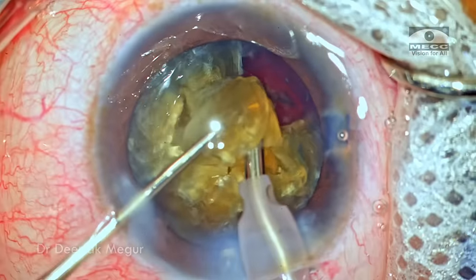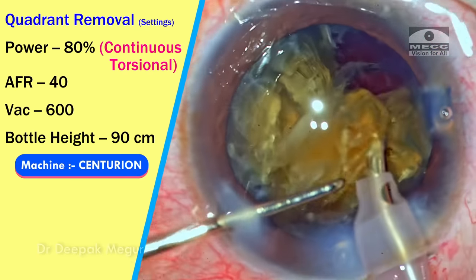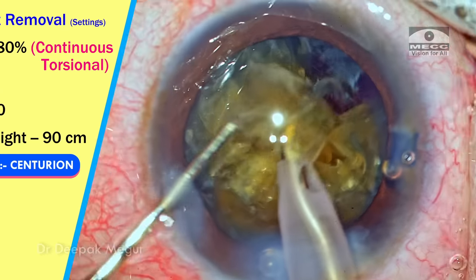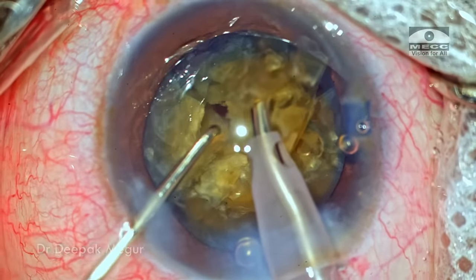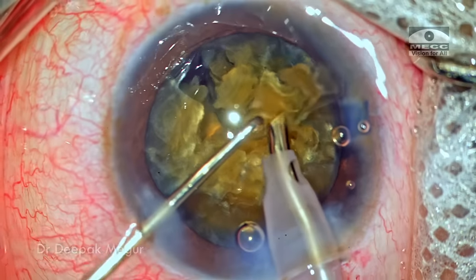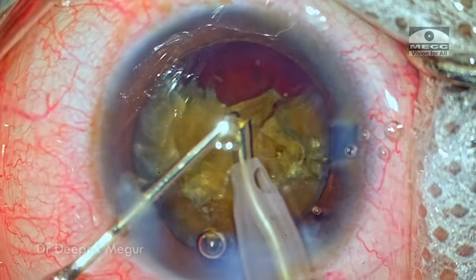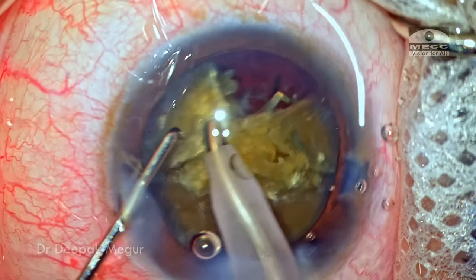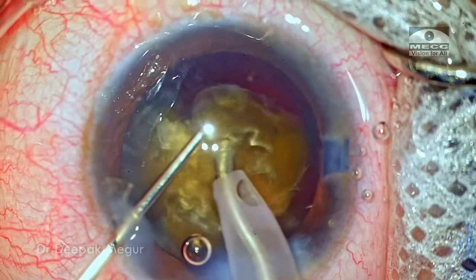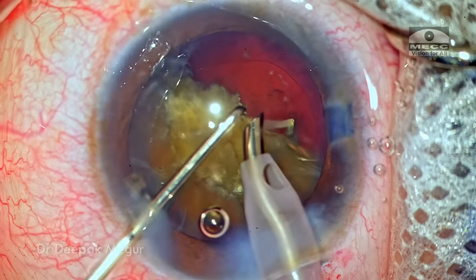The second hemi-nucleus has now been divided into three smaller fragments. The settings are again changed to quadrant removal mode, using torsional energy in continuous mode, which is extremely effective in cutting down these fragments into smaller pieces and emulsifying them. In a couple of minutes the first hemi-nucleus is totally emulsified. Each fragment of the second hemi-nucleus is grasped, brought up to the level of the rhexis margin, and then emulsified.